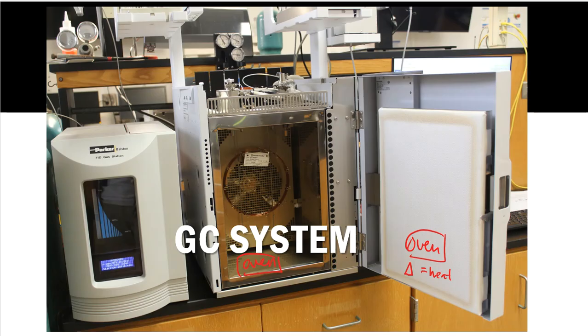So for our blood alcohol concentration lab, it's going to tell us a temperature setting that we need to be using for what they call our column. So we have gone into the software and we have inputted those values because we've got to follow those standard operating procedures. So we enter them in and we just double check them and make sure they look good. And if they look good, then ching-ching, we're off to the races, folks. We can start running samples.